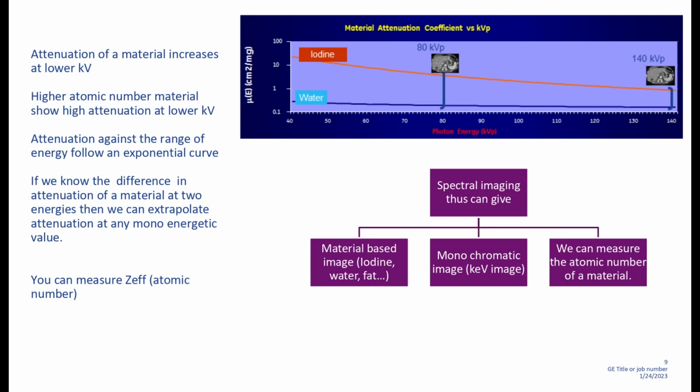In that, definitely you will see bone. There will be a natural question: I have suppressed soft tissue or water. So suppose there is a method to have three acquisitions or three energies, and then iodine, water suppressed, bone suppressed, then you will be able to do that. That's called triplets. But in your machine you have fed all the values for bone. At a given point of time, you can suppress only two materials. So if we suppress bone and iodine, we consider for the aorta.